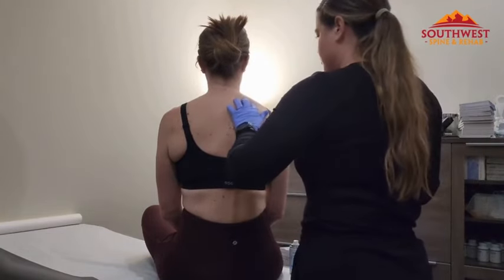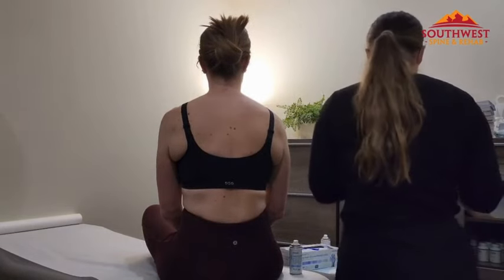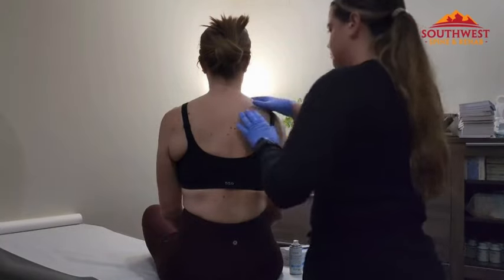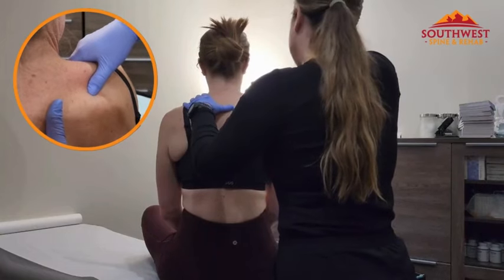Once a patient has gotten a trigger point injection, oftentimes we'll massage the area, we'll stretch the area, and we'll give you some things to do at home. Most patients report some mild discomfort, maybe some soreness once the lidocaine wears off, but nothing more than you would expect to get with a massage.